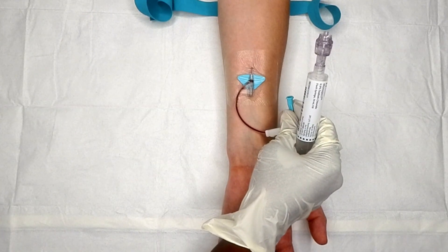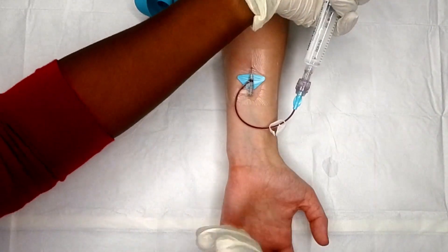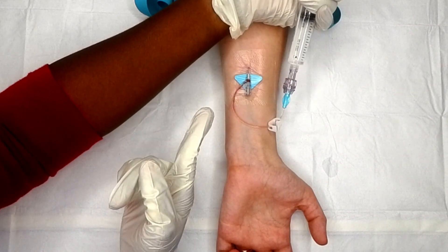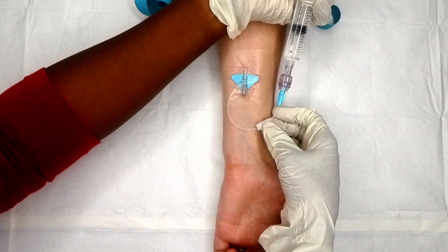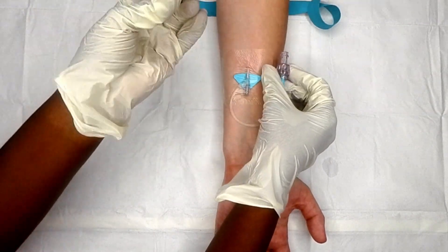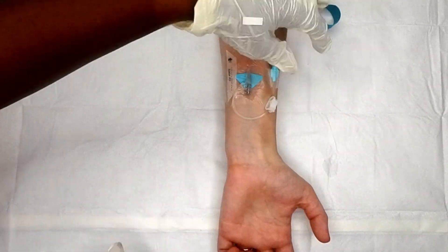Remove your tourniquet right away and secure your site. Clamp your IV, remove your vent cap, and connect your flush. When you flush, you're checking for patency, and you aspirate to confirm patency again. You're checking for infiltration or pain right above the insertion site. Remember to flush with positive pressure — as the plunger is going down toward the end, you clamp your flush to make sure the whole catheter is nice and clean.